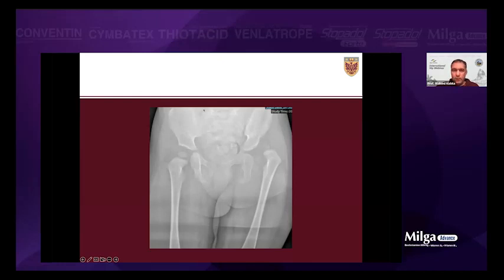Vicryl or nylon size 2 sutures, that's a very good point. I use something called Orthocord, which is kind of fiber wire, but it dissolves in about 3 to 6 months. But you can use Vicryl number 2. That's a very good option for the capsulorrhaphy. Excellent point.